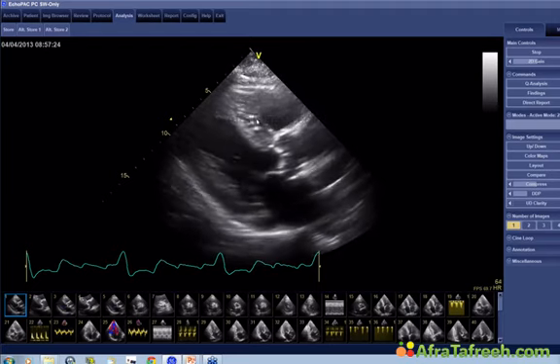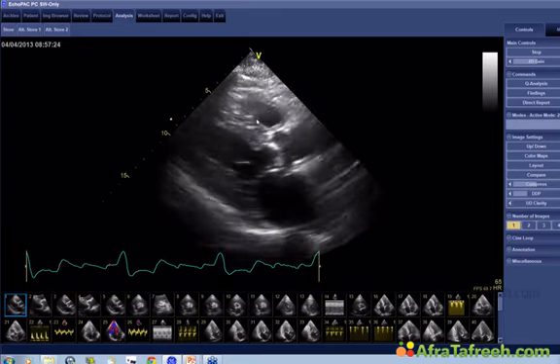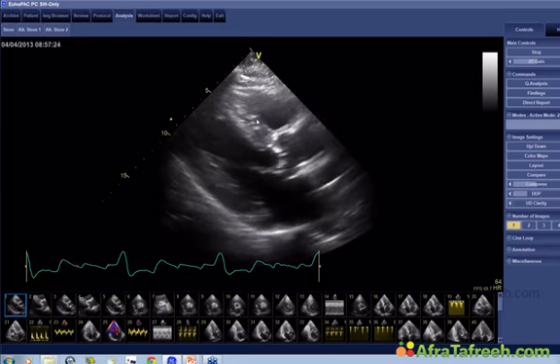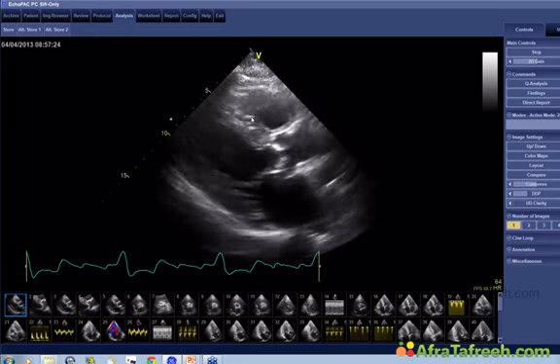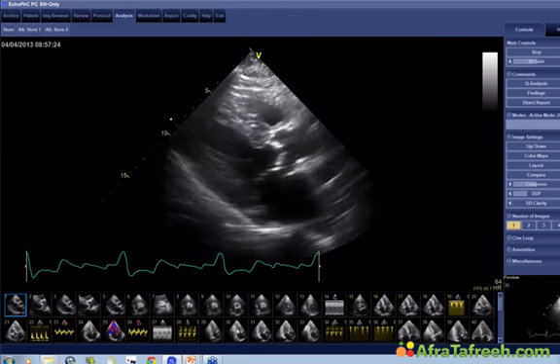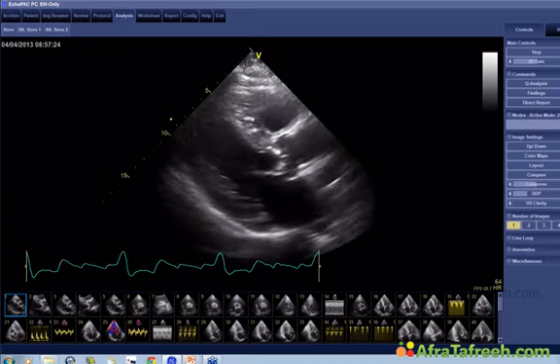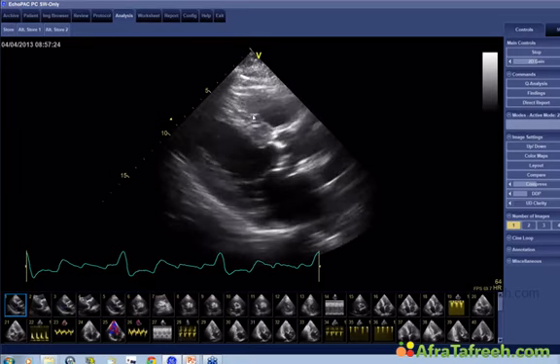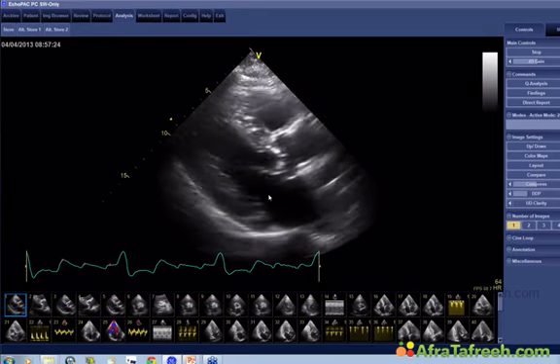But this does not mean that every patient who has severe hypertrophy has severe aortic stenosis, because remember, the patient can also have another cause of hypertrophy, as in this case, hypertension. So in this patient I would say his hypertrophy is pretty significant, so that would fit quite well to severe aortic stenosis. I hope you agree. I will then show you a 4-chamber view where you can see hypertrophy even better.